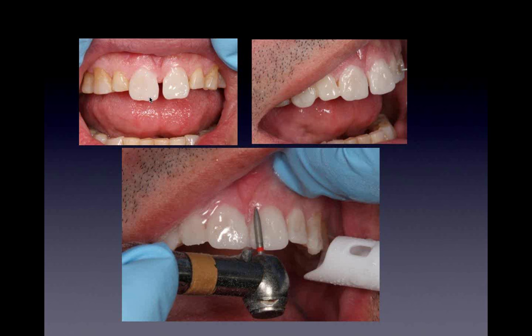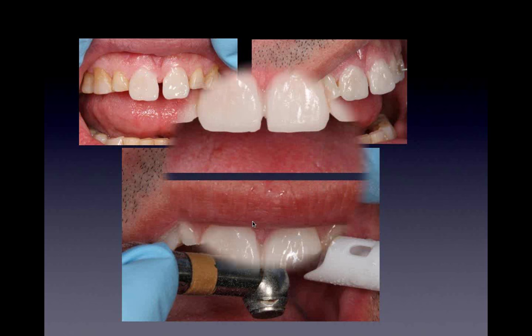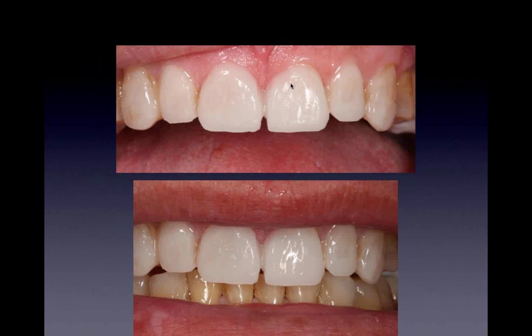So we use flowable composite just with hand carving, and then I start carving it. I do my laterals, my canines. He wants a little gap. Remember, the gap that they see is this. You can always keep it connected here. You don't have to go through the gap all the way through just to show them. This is layered exactly on the tooth, on the tissue. So this is just laid on the tissue.